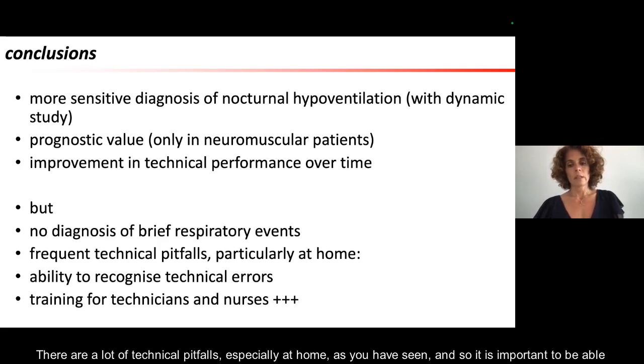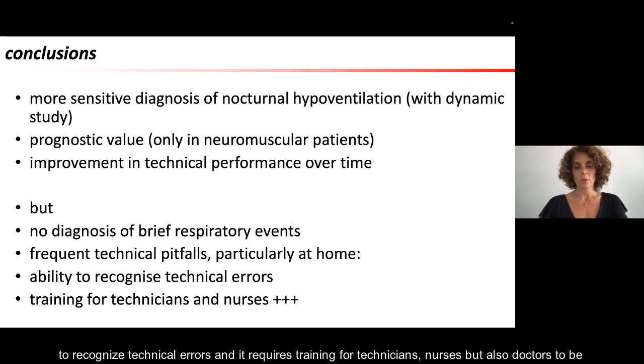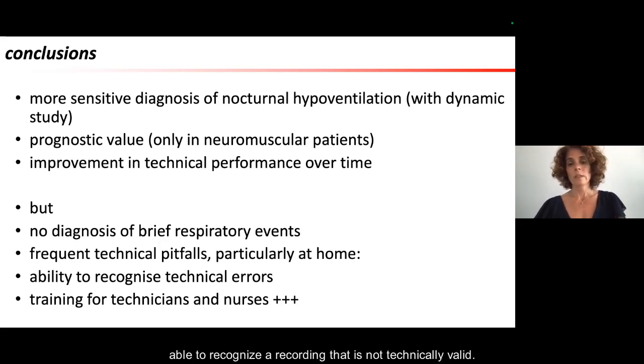There are a lot of technical pitfalls, especially at home, as you have seen. And so it is important to be able to recognize technical errors. It requires training for technicians, nurses, but also doctors to be able to recognize a recording that is not technically valid.